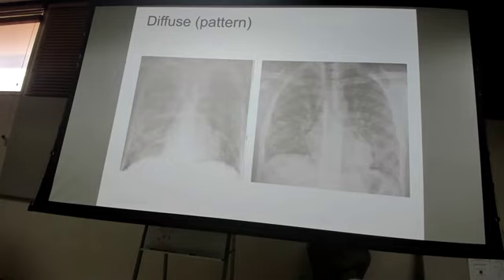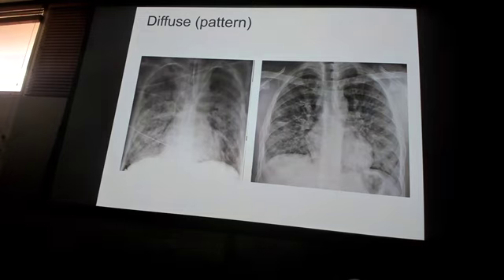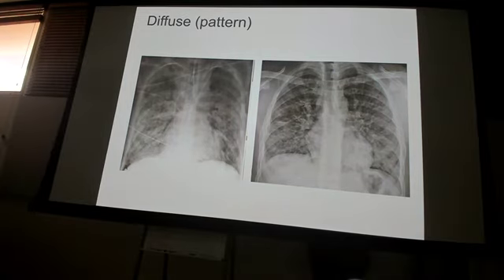This one on the left, what am I looking at right here that's coming out? These are your lungs, right? This is your trachea, this is your carina right here. You see that dark line? What's this guy right here? Yeah, the tracheal tube. And these are just some leads for what we're seeing.